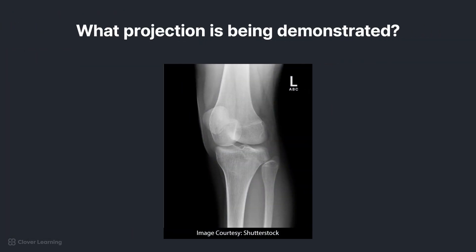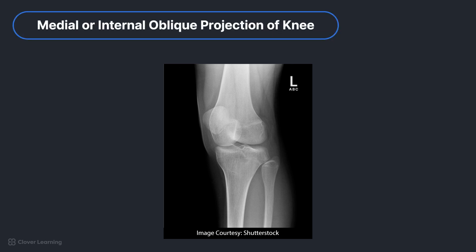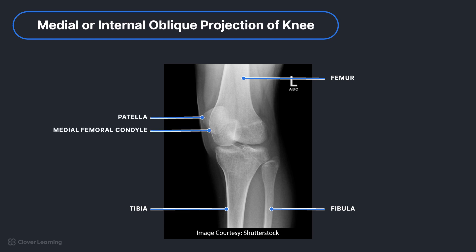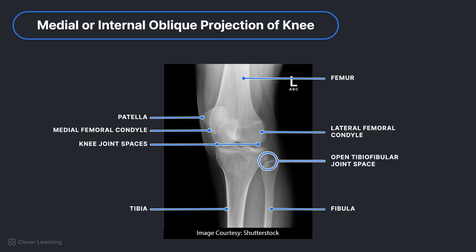Which oblique projection of the knee is being demonstrated in this radiograph? How do you know? This is a medial or internal oblique projection of the knee. For this projection, the distal femur and proximal tibia and fibula should again be visible, along with the patella superimposing the medial femoral condyle. The lateral condyles of the femur and tibia should be well demonstrated, and the medial and lateral knee joint spaces will appear unequal. One main distinguishing feature of the medial oblique is the open proximal tibiofibular joint space.